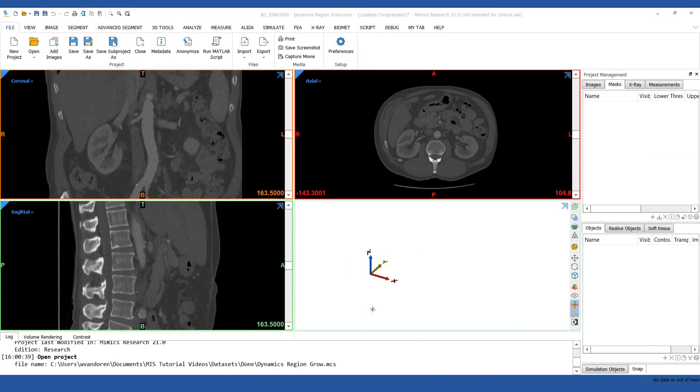Hi, I'm Robin and I'm an application engineer at Materialize. Today I will show you how to use dynamic region growing in Mimix.